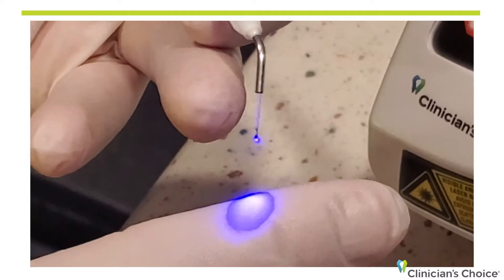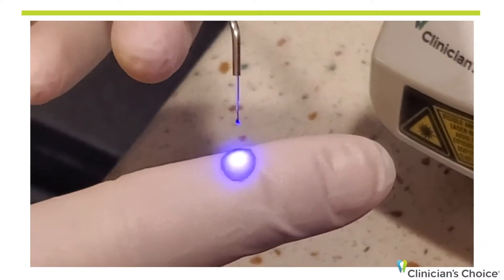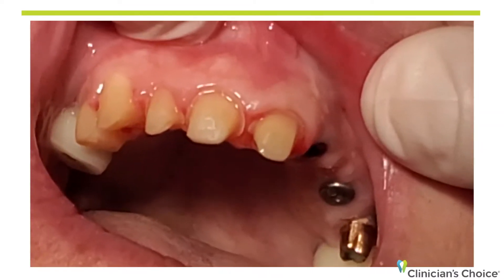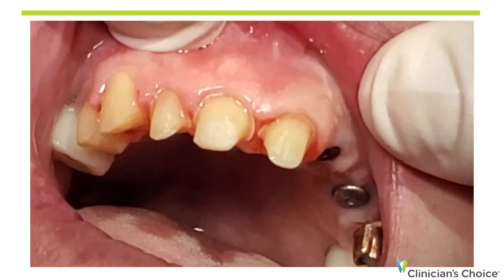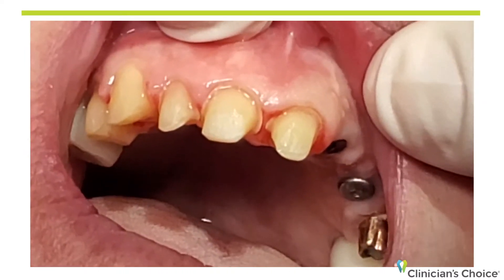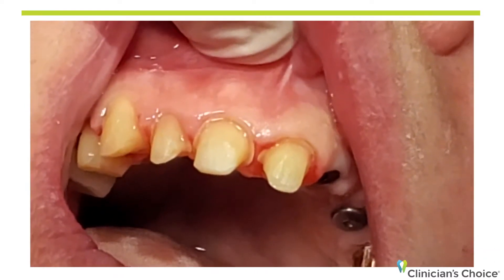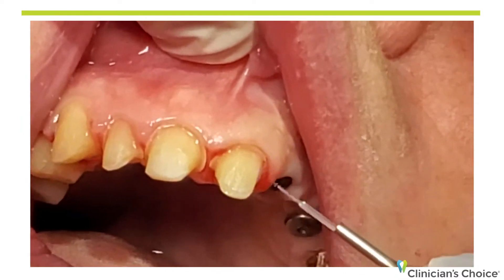What we're going to do now is go to the mouth and do some troughing — some anterior crown and bridge — at low energy with the Blue Wave laser from Clinician's Choice. We're at six tenths of a watt. Why so low? Because we're in the front of the mouth, in the anterior, and we don't want any recession.